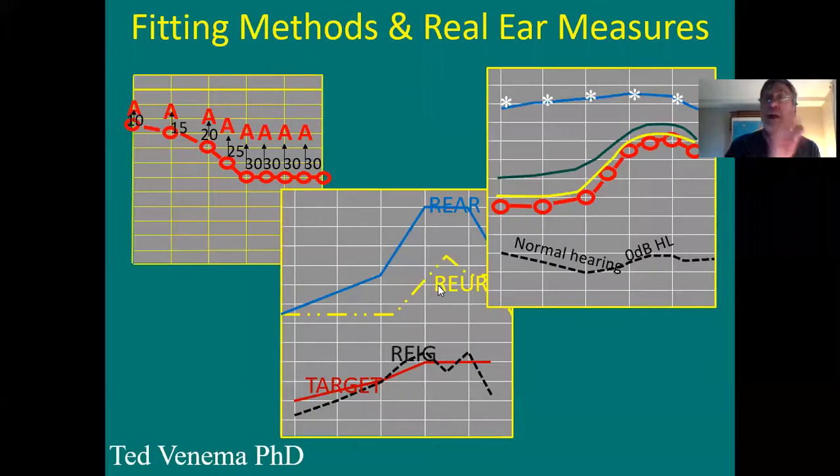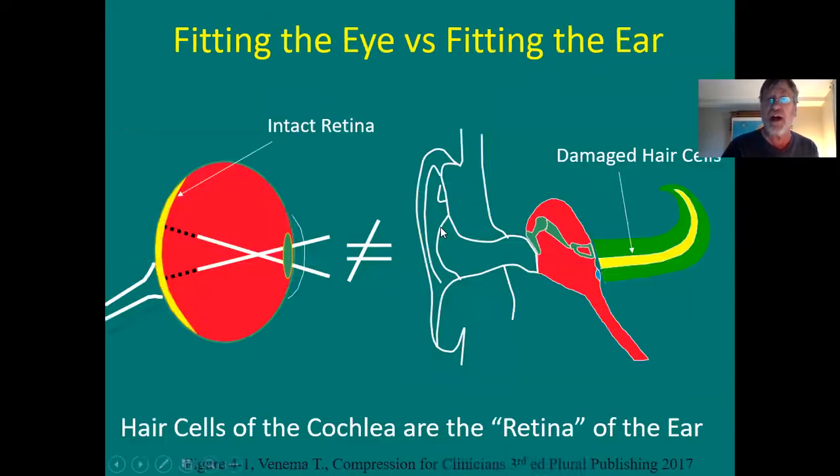So when you look at this very first slide in this PowerPoint presentation, you'll see three squares. On the left is called functional gain, the middle one's called insertion gain, and the right one's called in situ output. These are the three ways that hearing aid fittings were verified, that you proved, are you getting what you said you'd get? So let's look at the next slide here.